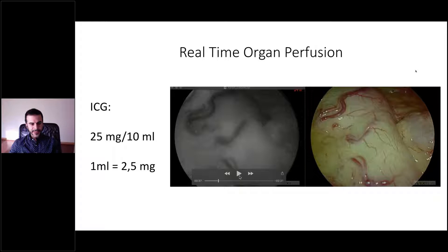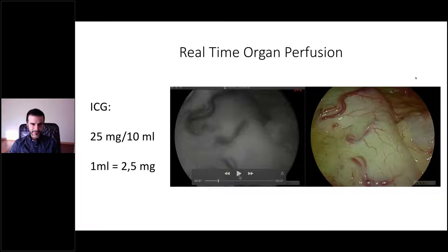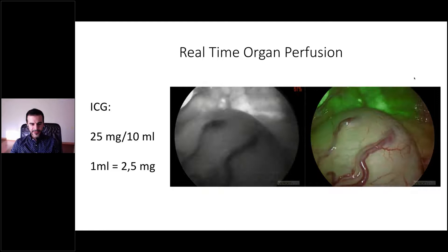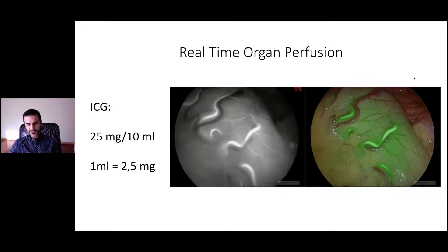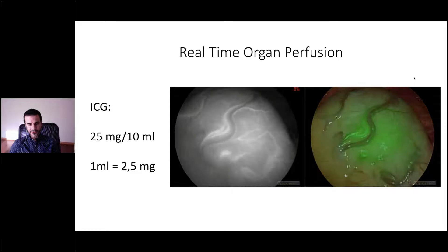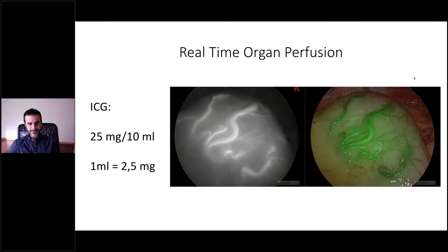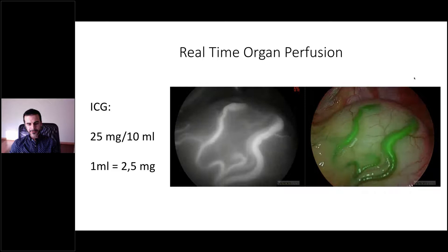The dilution I use is 25 milligrams in 10 milliliters of distilled water, and one milliliter is injected each time you want to measure perfusion. It is important to recognize the phases: after injection, 30 to 40 seconds pass before ICG reaches the arteries. The arterial phase lasts approximately 20 seconds and the venous phase another 20 seconds. Between 60 and 90 seconds after injecting, the decision must be made and the well-perfused area is marked.